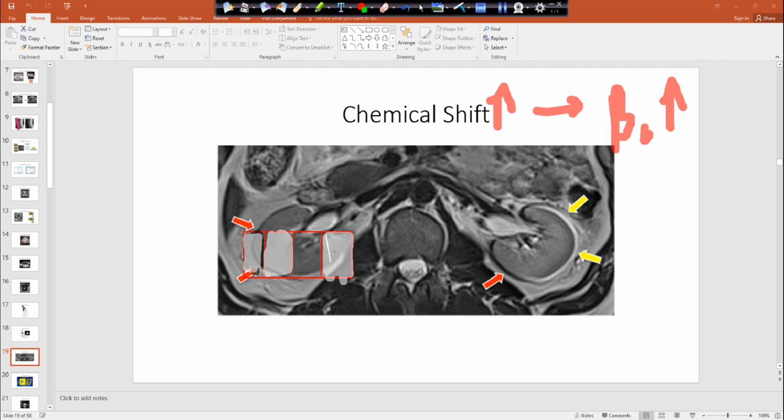So that's why if you're working on like that Hitachi at Resurgence Roswell, they don't ever have to worry about chemical shift because their field strength is so low that it won't even be an issue. So you really only kind of see these things on 3 Tesla magnets because a lot of times 1.5 is still not even strong enough to see a lot of chemical shift. So if you scan at lower field strengths, but if not, increase our receiver bandwidth, widen it out, and it will reduce that chemical shift.